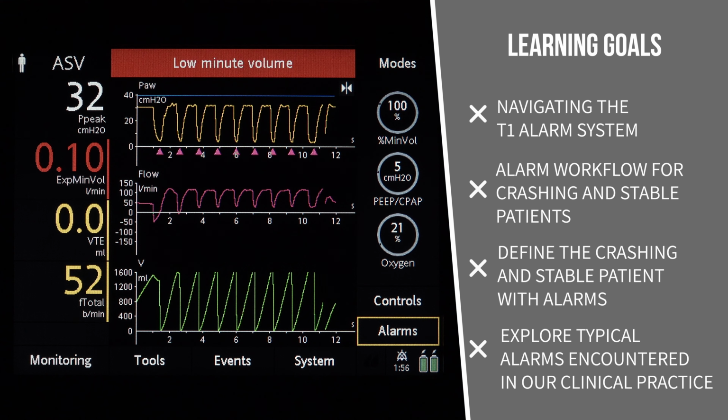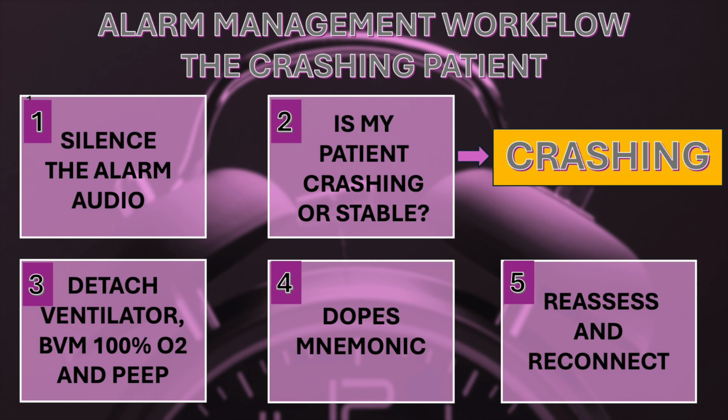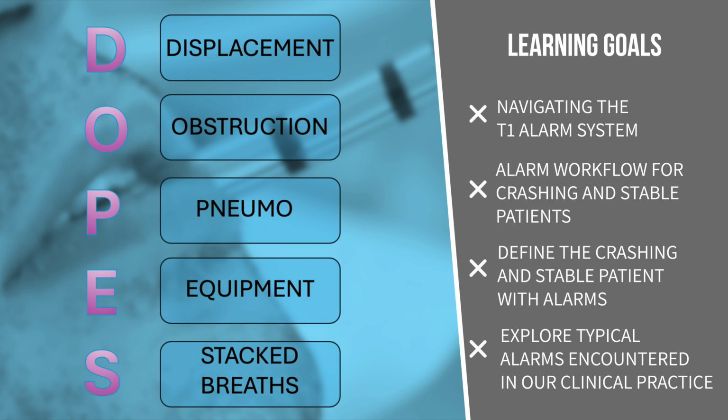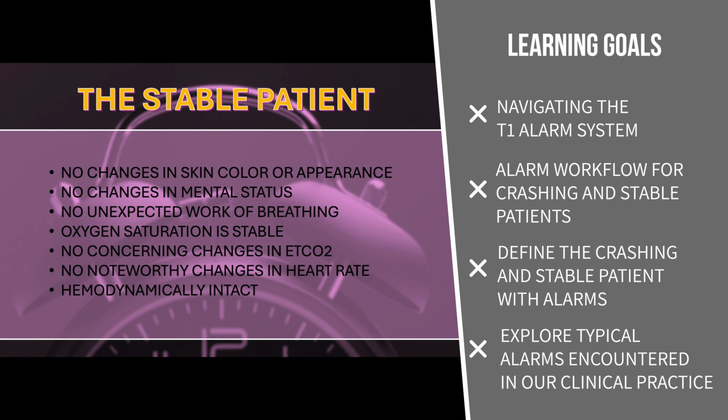situation you may encounter. Therefore, our primary aim is to establish a standardized alarm management workflow for crashing and stable patients, focusing on patient safety. For clarity, we will establish clear definitions of the crashing patient and the stable patient with alarms.